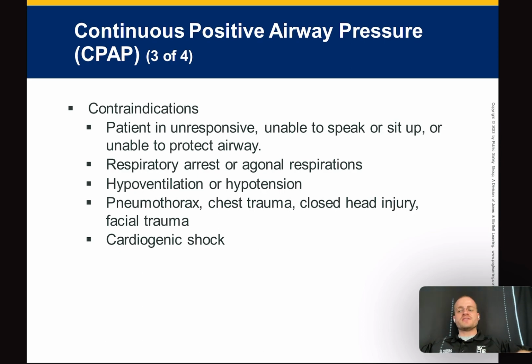It's not doing that. It's continuous. It's just blowing air. It's not like a ventilator, right? So it's just continuous air. And then if they're hypoventilating or hypotensive, again, you can't use this.